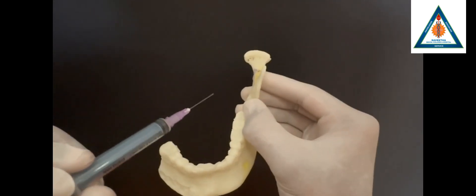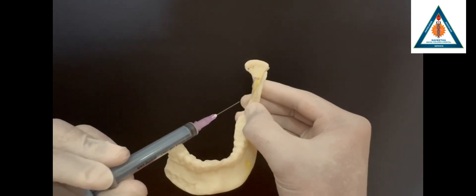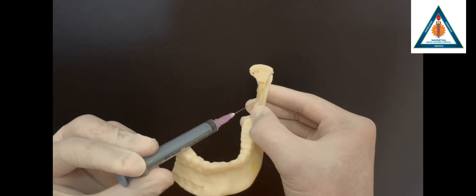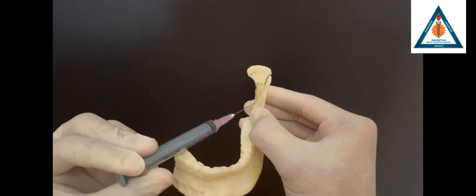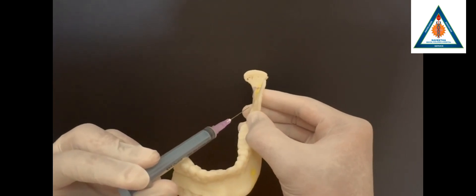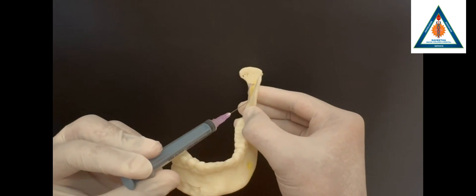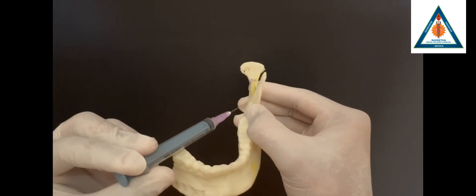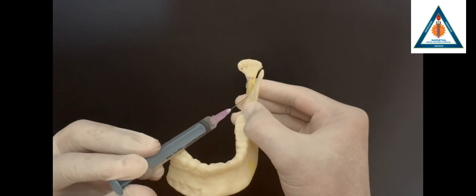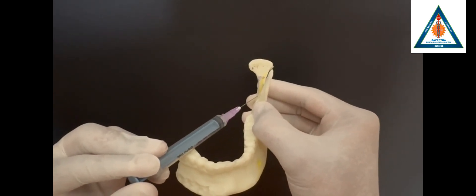On the occlusal surface of the premolars, consider a horizontal imaginary line, then anterior-posterior position and depth. You consider from the premolars and the point of entry will be in the pterygomandibular raphe. Then go posteriorly and touch the bone. Once you feel the bone, aspirate, then deliver 1.5 to 1.8 ml of solution over there.